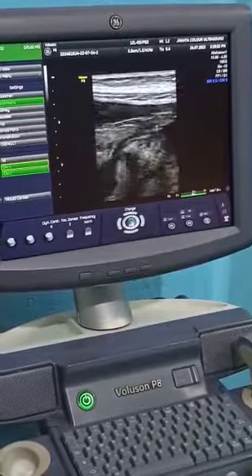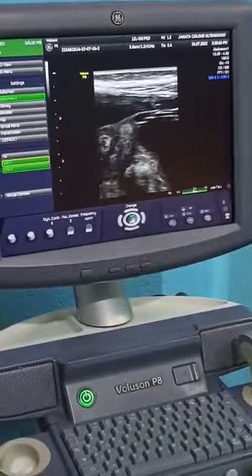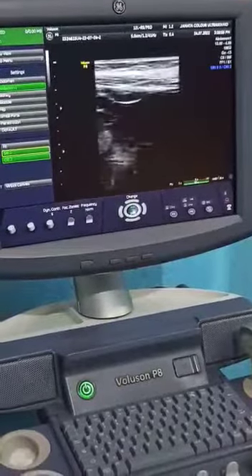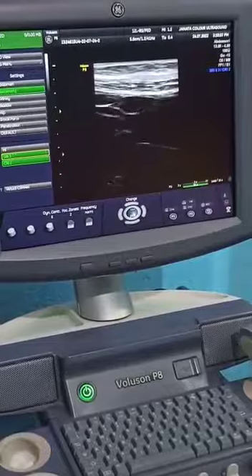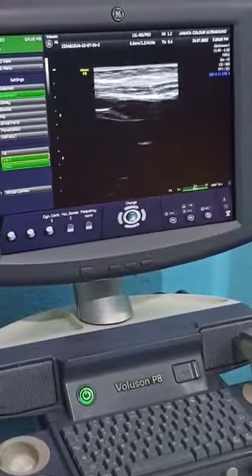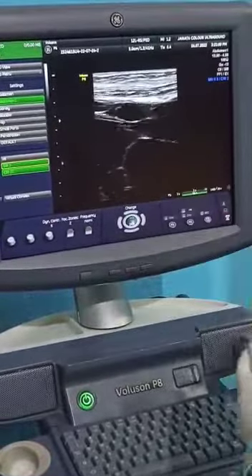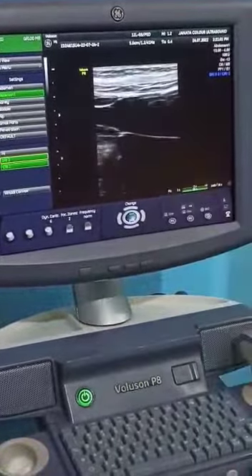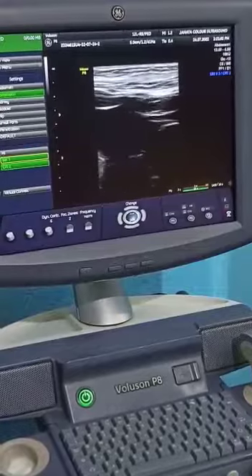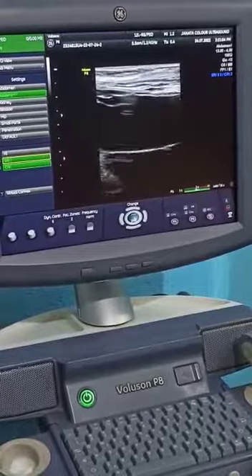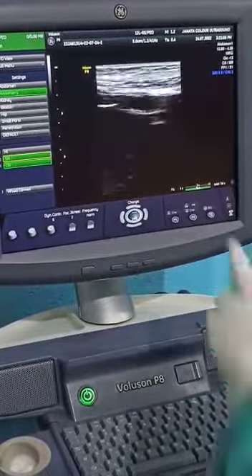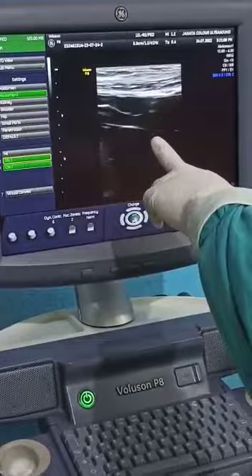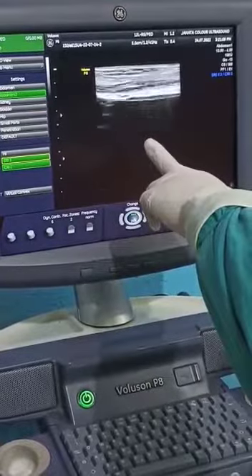While doing ultrasonography, you must be noticing the peritoneum is full of free fluids. Most septated fluids are there in the peritoneal cavity. This is free fluid with internal septations.